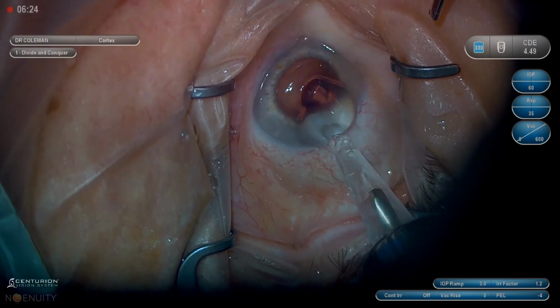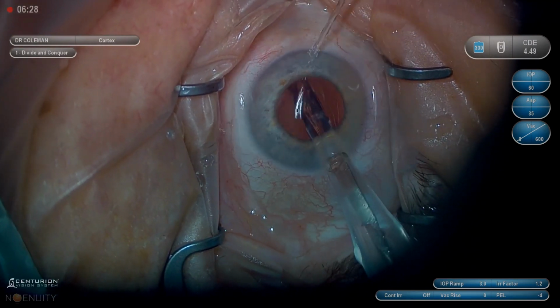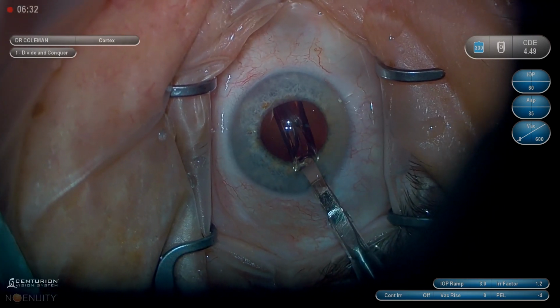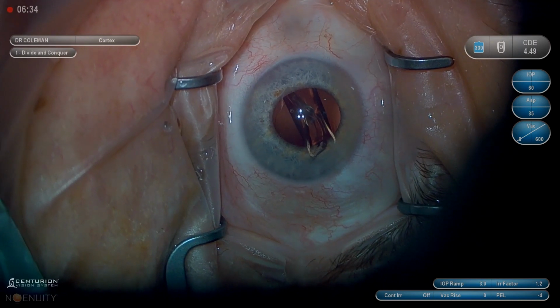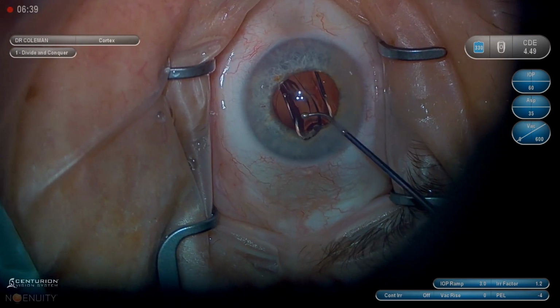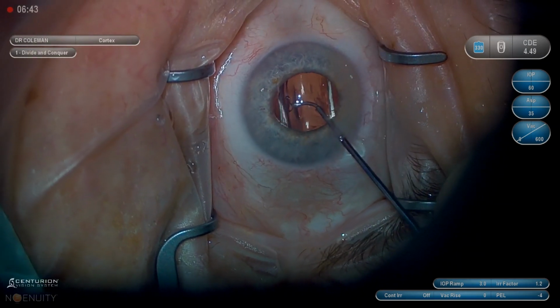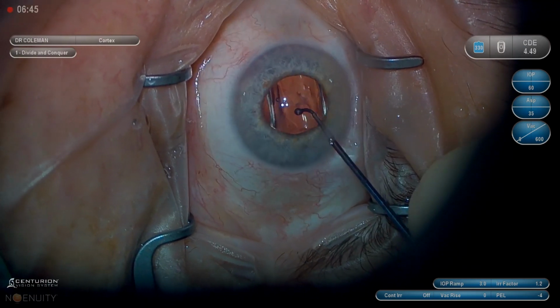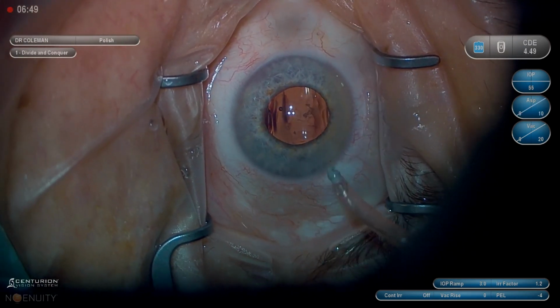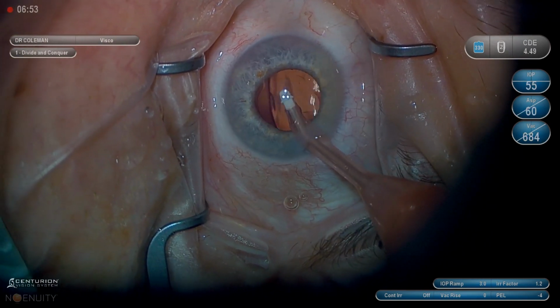I inject bevel up. I do not stabilize the eye. I can stabilize the eye by pointing down with my lens injector with the end of the cartridge, and I usually do not have to use a second instrument in the paracentesis to stabilize the eye. I think it makes a paracentesis leak slightly more often to do that. Now, my partner differs on this. He uses the Connor in the paracentesis to stabilize the eye and goes in bevel down rather than bevel up. If I go bevel up, he goes bevel down. Both seem to work fine.